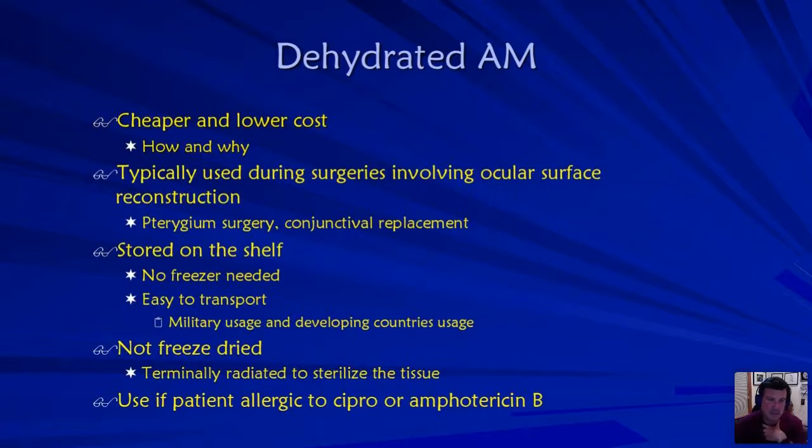You're going to see when you get the cryopreserved, and we heard a little bit about pentraxin 3, and I'll cover that in that heavy chain hyaluronic acid, which is extremely important in the wound healing. They can be stored on the shelf. They're not freeze dried.